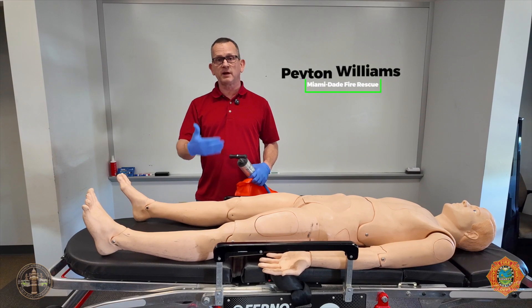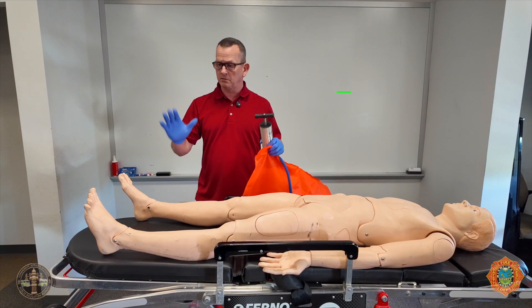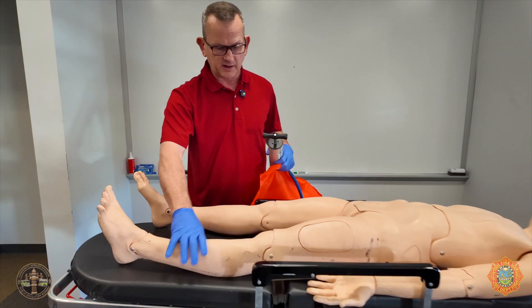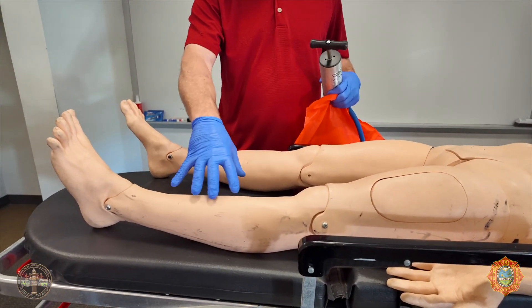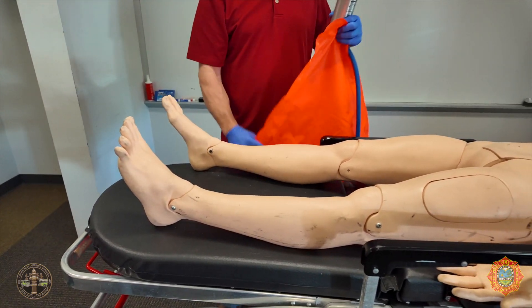Hi, my name is Peyton Williams. I'm demonstrating how to use the vacuum splints. First thing is BSI Scene Secure. This is the leg that has a deformity and discoloration. We're going to check for a pedal pulse. If there is a good pedal pulse, we can use this device.